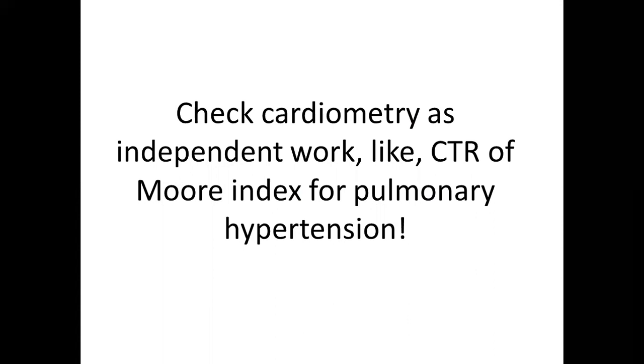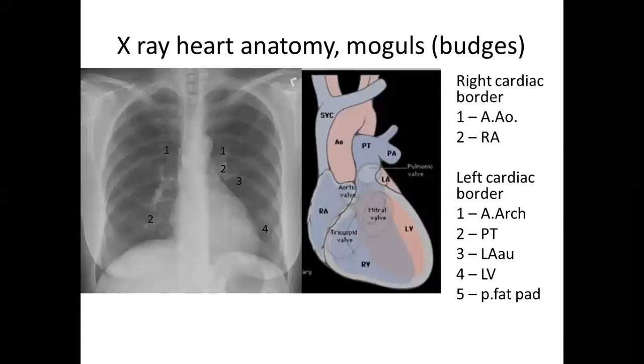As homework, as independent work, please check out the cardiothoracic ratio, basically cardiometry, and the index MORE. Index MORE is used in fast checking of pulmonary hypertension.